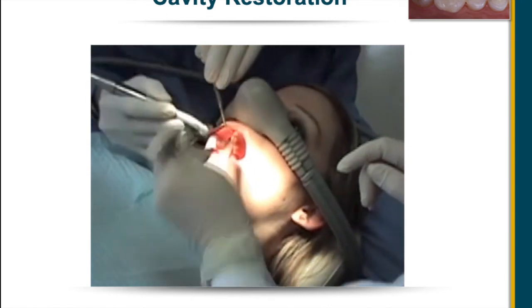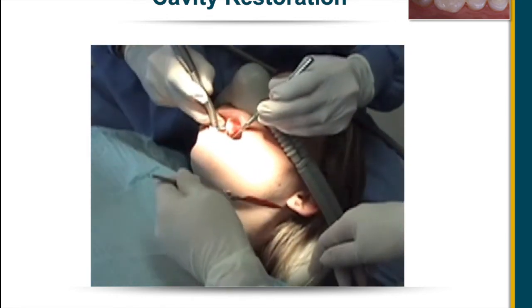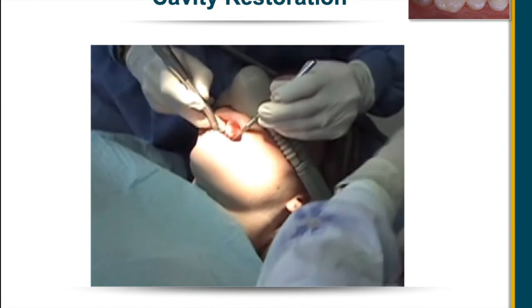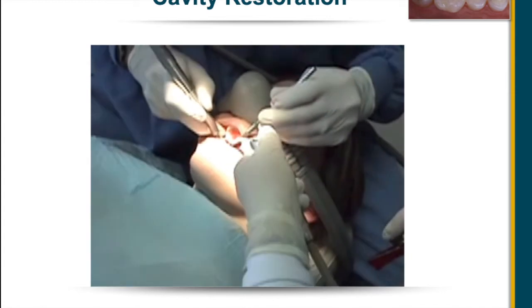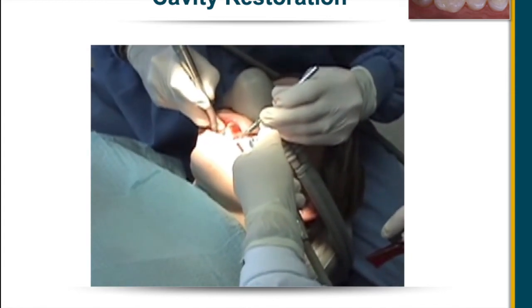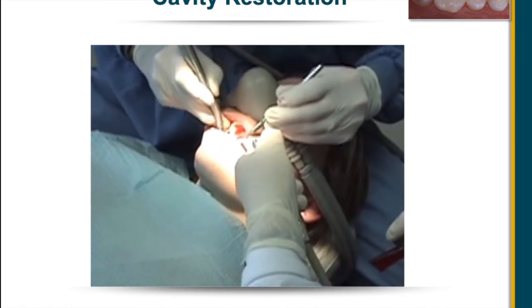The doctor continues with the adjustment. This may be once or twice, it may be many times. It just depends on the filling. The assistant should always be prepared to blow dust off the tooth and prepared to re-enter the mouth with the articulating paper in an efficient manner at any time.